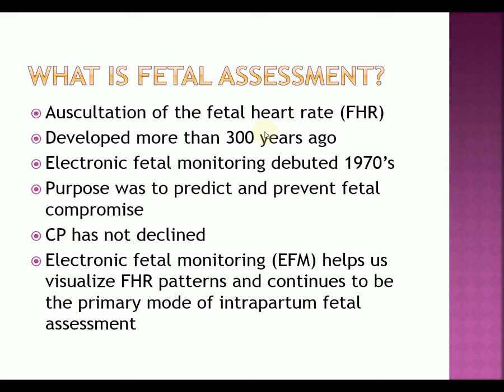What it actually does is make the nurse's job easier, as far as being able to see that fetal heart rate anytime they look at the strip or at the monitor out at their desk. Instead of just hearing the heart rate to see if it's high or low or changing, the electronic fetal monitor helps us visualize those fetal patterns, which we may not see if we were just auscultating every so often.